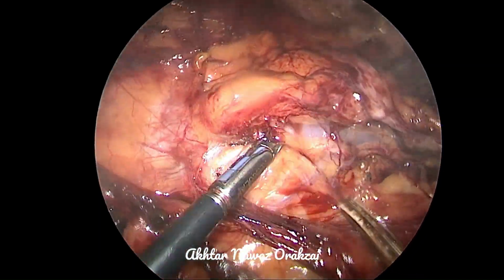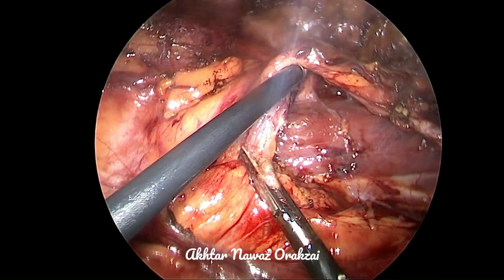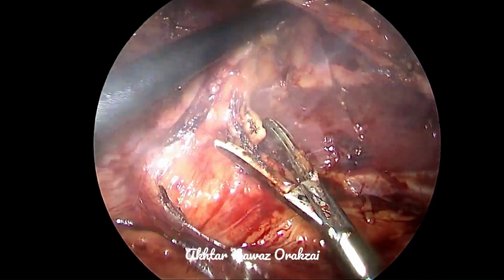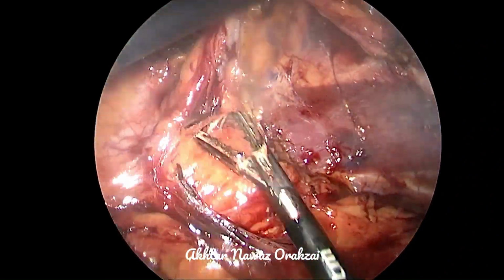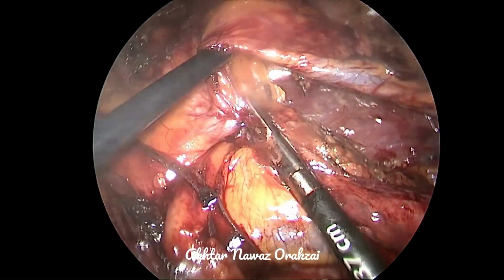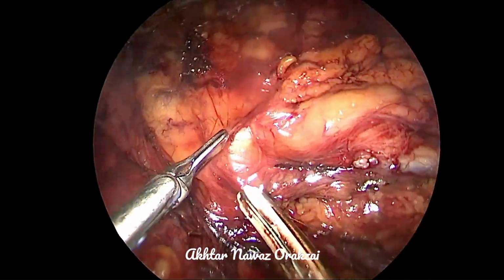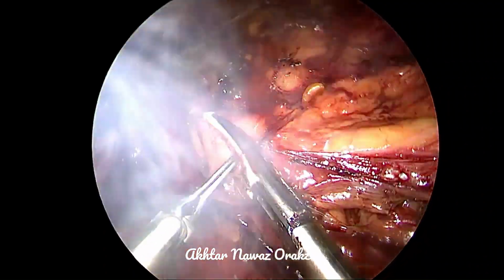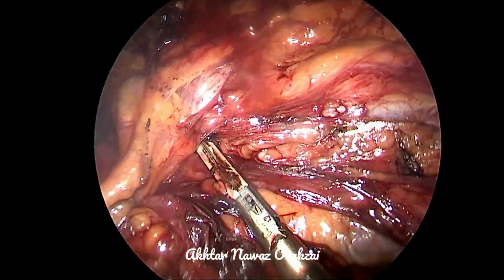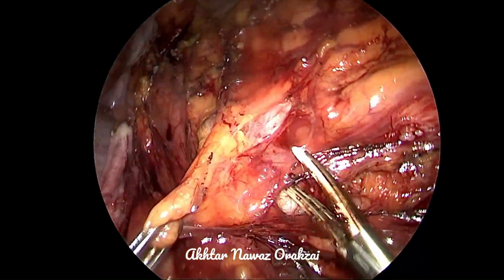Discussing the series of various pedicles now. We have mobilized the left colon, identified the gonadal vein and the ureter, and dissected the lower pole. We are marching towards the pedicle, following the gonadal vein, dissecting the area where the gonadal vein is leading us.